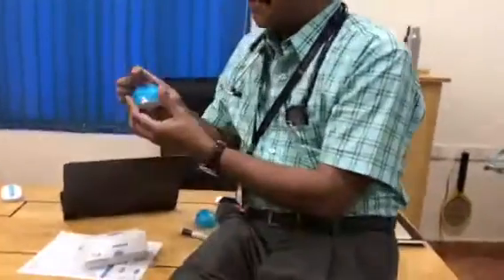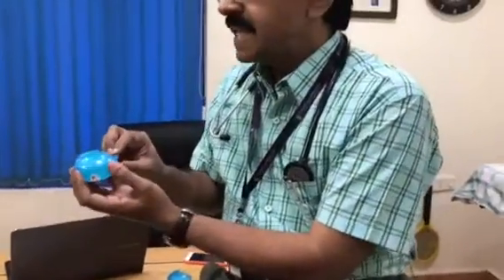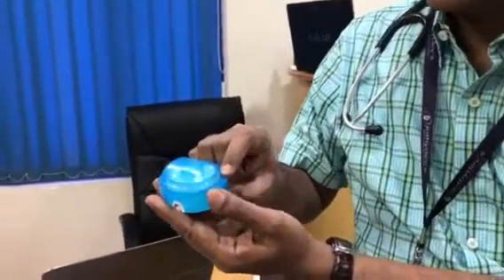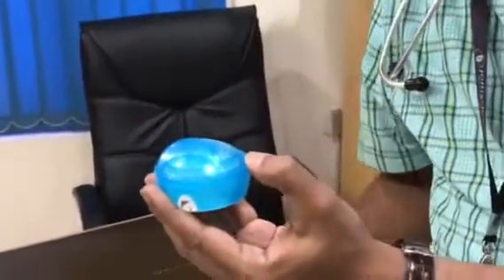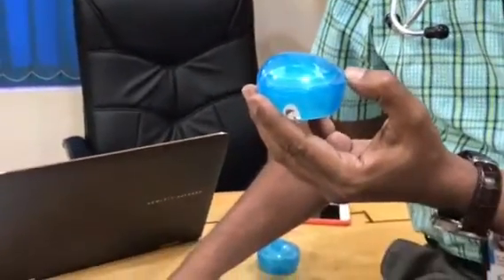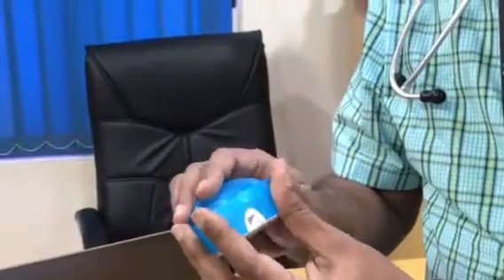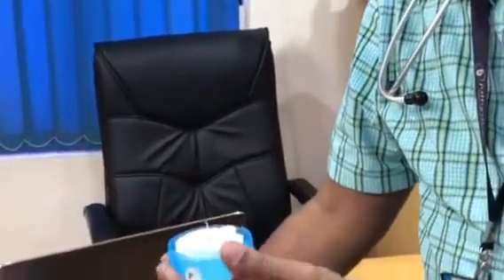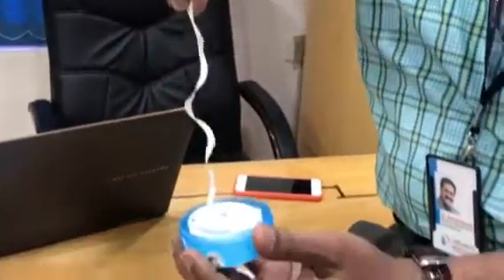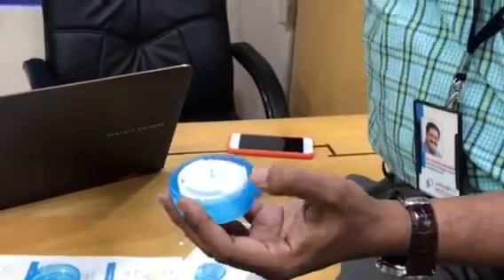I'm going to open the package — removing it and opening the lid. It is available in two lengths of cannula: this one is 6 millimeter, and it is also available in 9 millimeter length. Only a very soft cannula goes inside — there won't be any metallic part inside the skin.